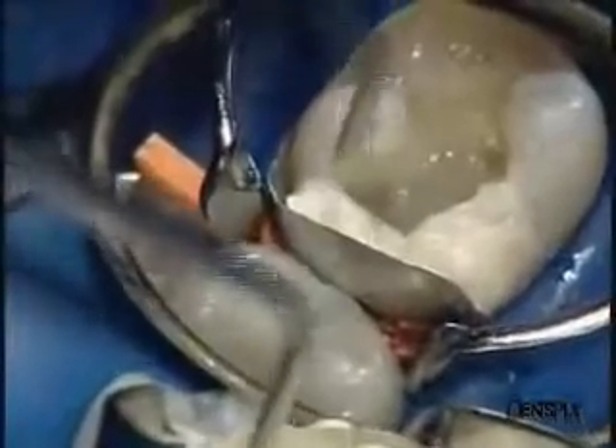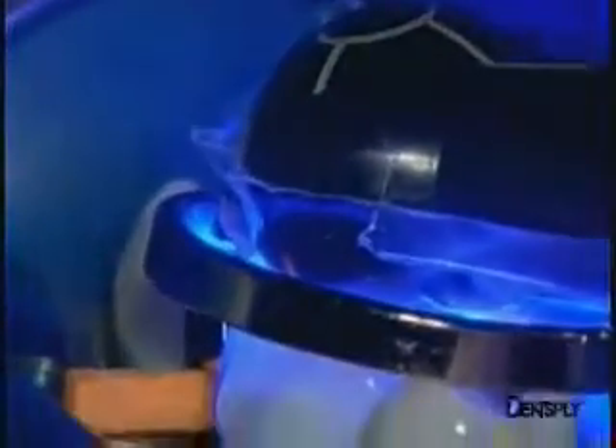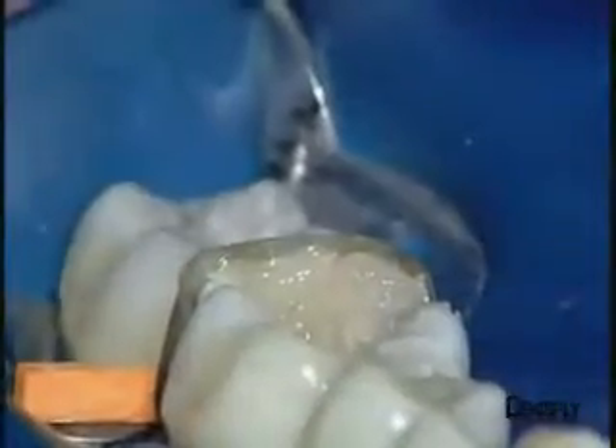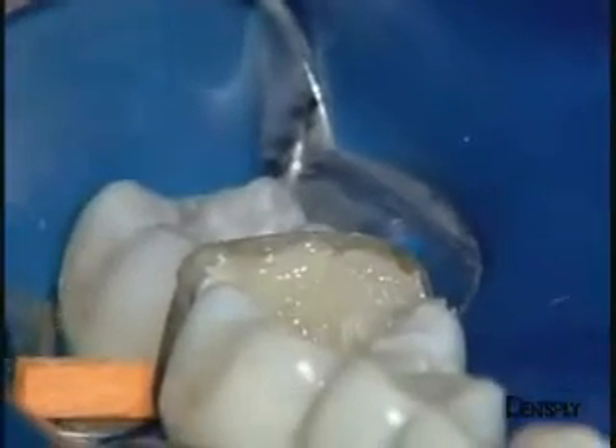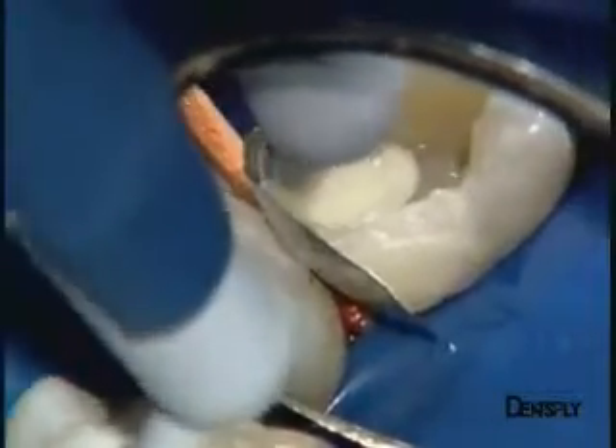We therefore fill the whole proximal zone, contact point zone and distal marginal crest and light cure. This view shows the whole of the distal marginal crest which is slightly higher than the neighbouring tooth in order to allow later corrections to be made.